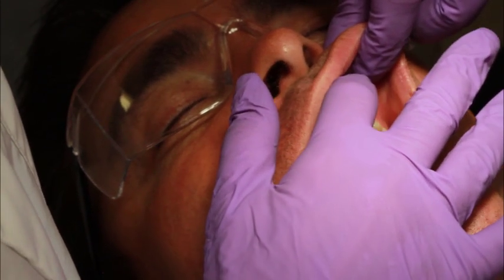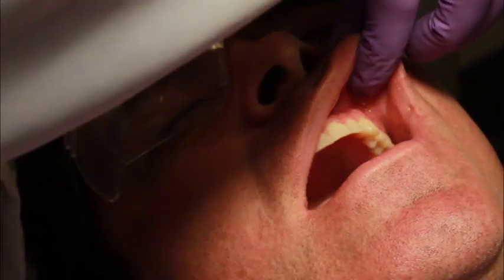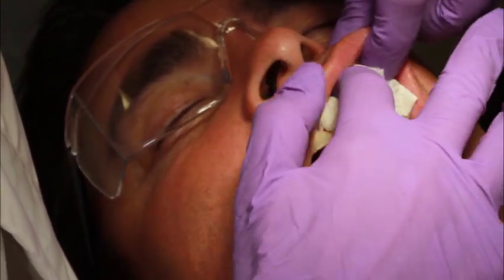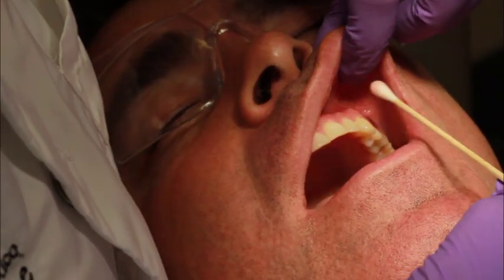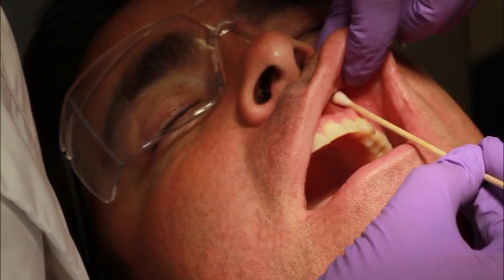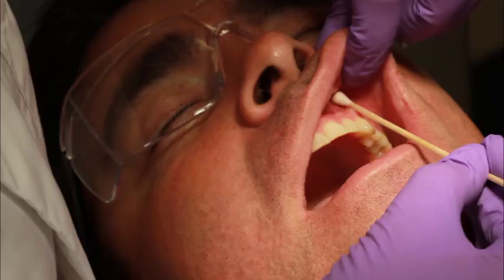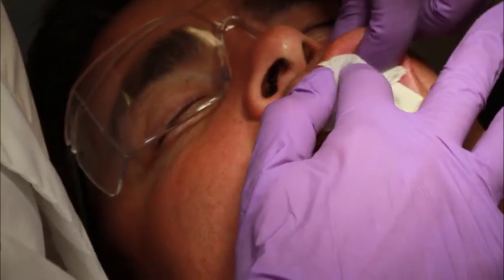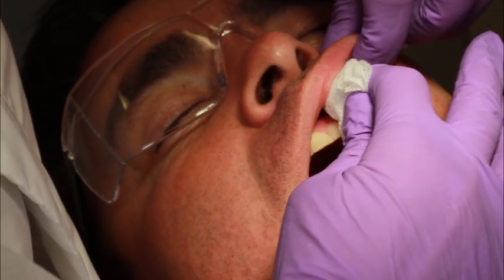Palpate the injection site to ensure that only soft tissue is injected. Dry the penetration site and prepare the alveolar mucosal tissue with topical anesthetic in the vestibule at the height or depth of the mucobuccal fold at the apex of the selected tooth. Topical anesthetics are most effective for patient comfort when applied for 1 to 2 minutes. Dry the tissue to remove any excess topical anesthetic.